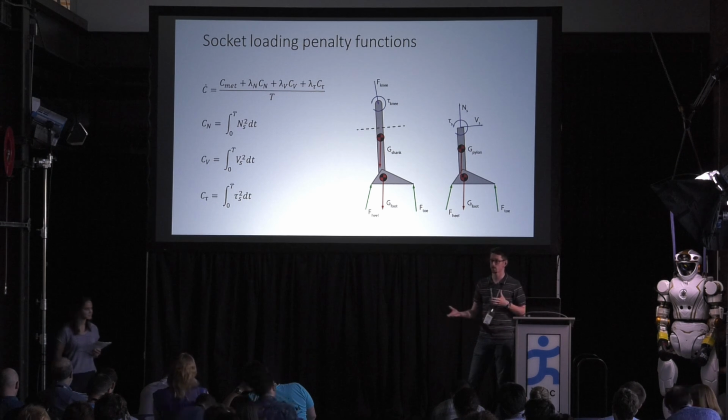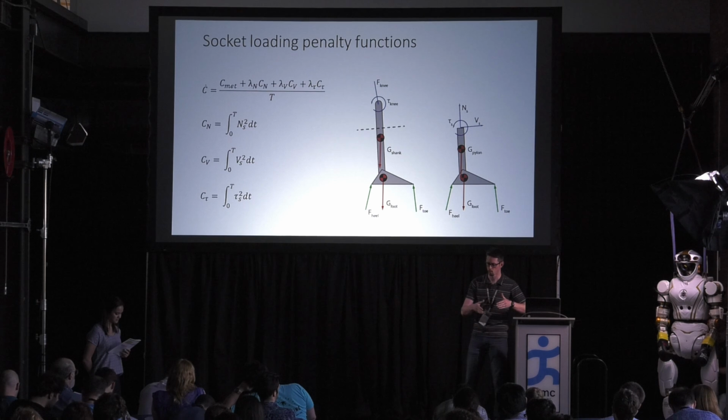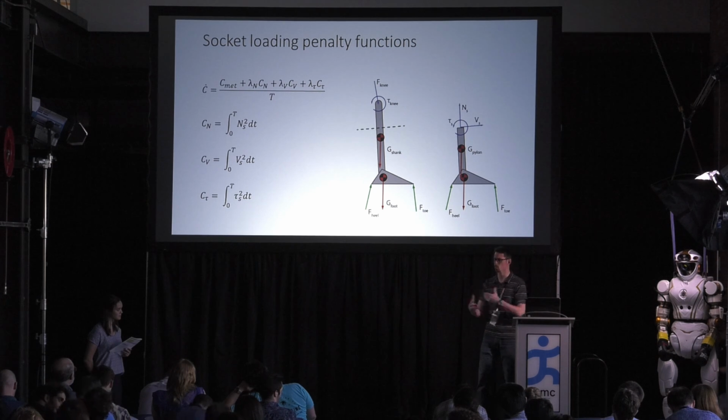And some of it could also just be training. They're not used to walking on something that they can't feel. They can't feel the ground with the prosthesis, so they're still working with the leg that can feel the ground, and with enough training, with enough work with a prosthetist, they might learn to trust that limb a little bit more.